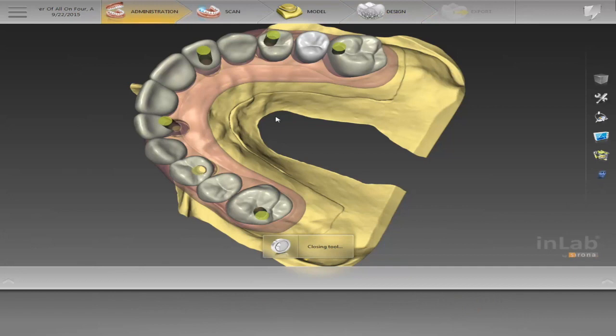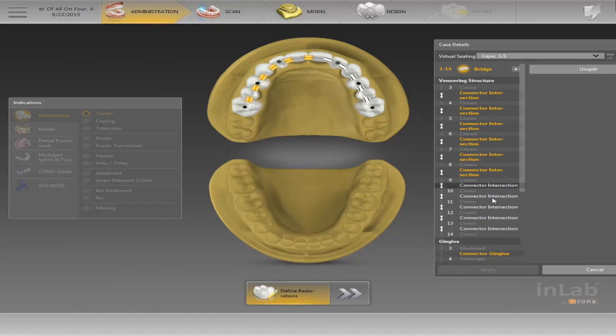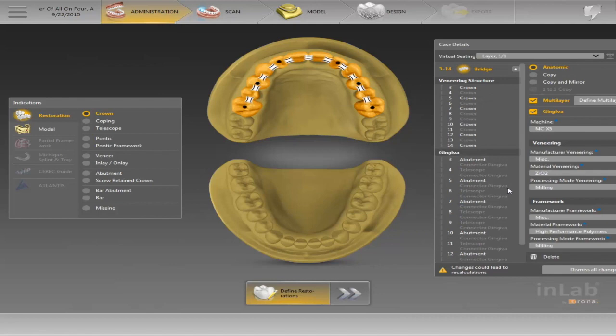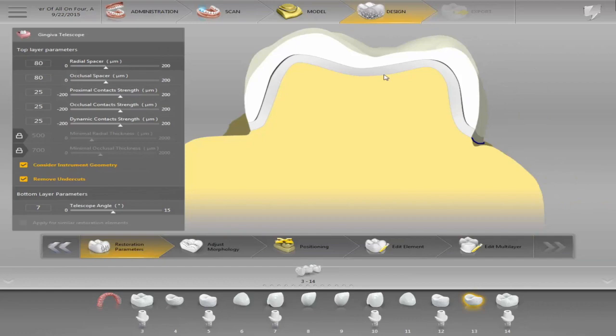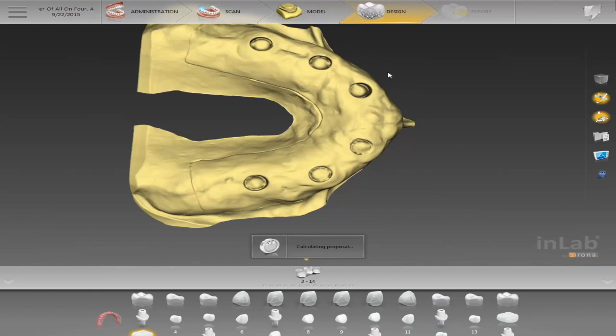If I go back to administration, I can change this and say I want them all to be single units — I hold down Ctrl, click on all the different connectors for the case, then click Unsplit and Apply. Now when I move forward they can be single units. What's cool is you can do single units for anteriors and bridges for posteriors — whatever combination you want. So now they're all single units, and I have my Trilor and my crowns to mill out in whatever material I want.